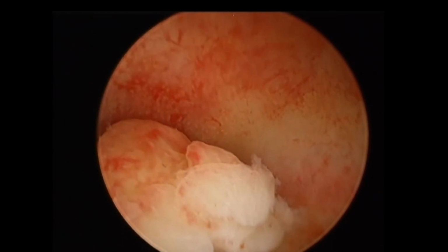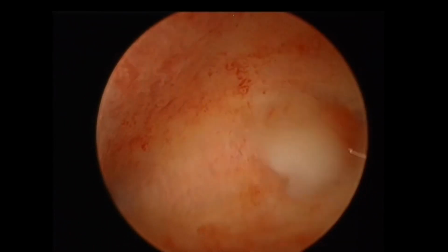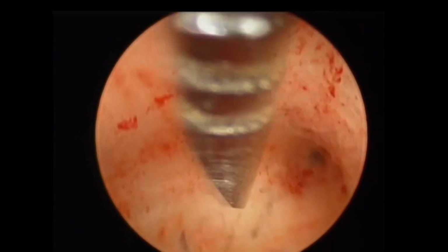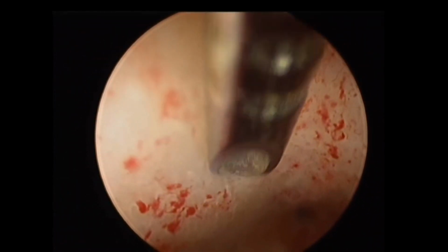Once the polyp is free, it starts to dance and rotate inside the cavity. How do you do this? It's by using the fluid jet to hit the fundus, and then the turbulence will make the polyp dancing like this.